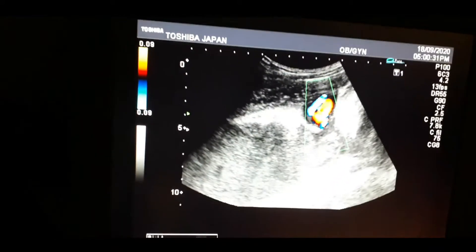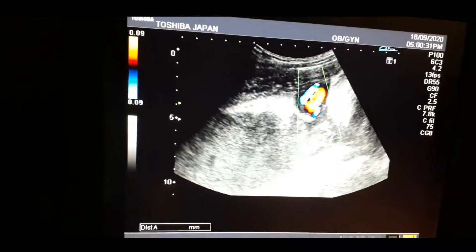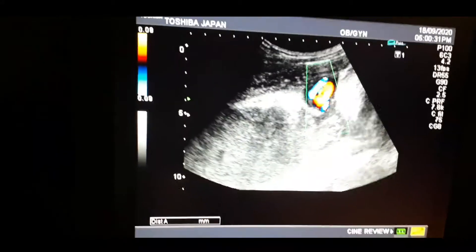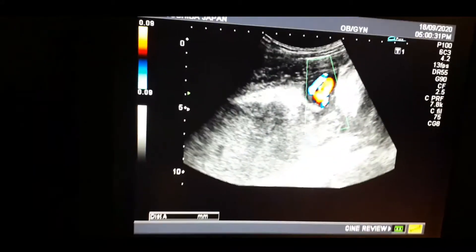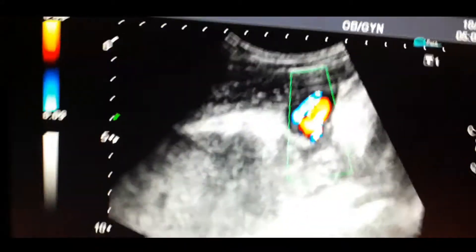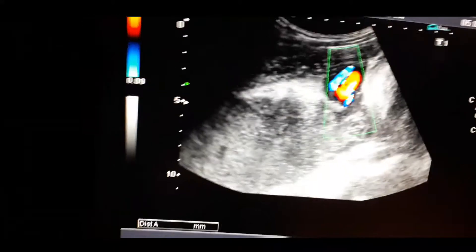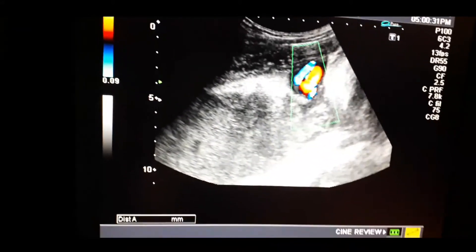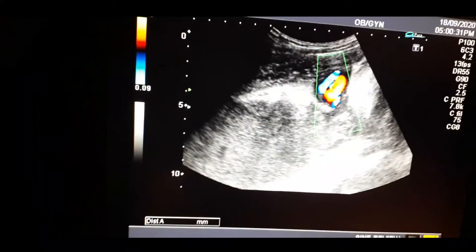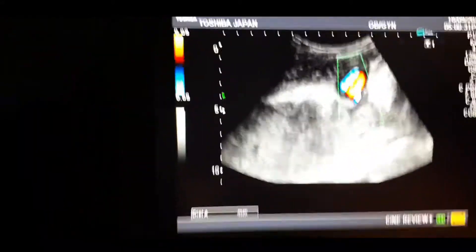So there are three vessels and this is a single loop of cord. And if there are six vessels, then it shows two loops of cord.